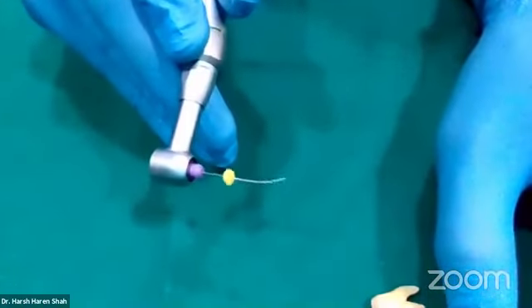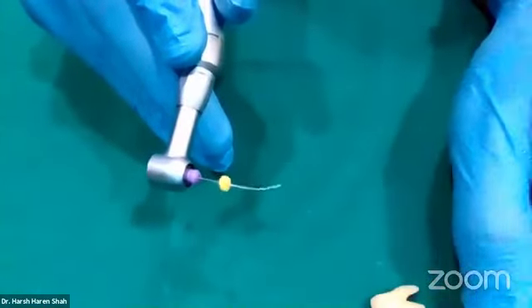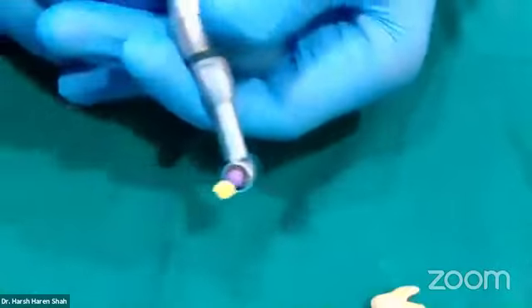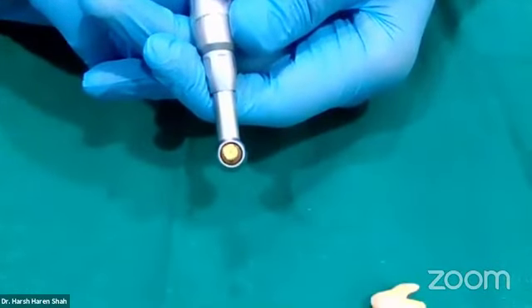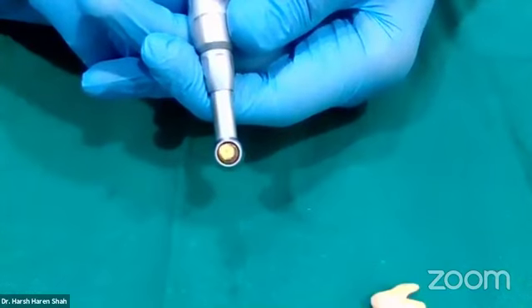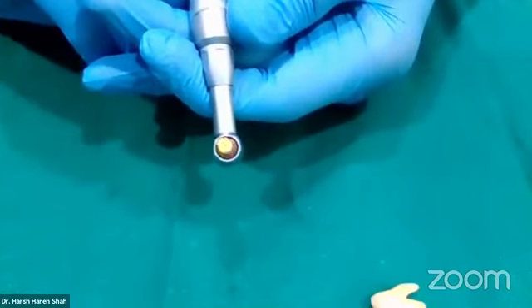Can you see how the file is oscillating here? This is the kind of watch winding that we are talking about. In this view, you can see how the stopper goes clockwise, counterclockwise, clockwise, counterclockwise, 30 degrees clockwise, 30 degrees counterclockwise. So that's how it completes that arc stop.